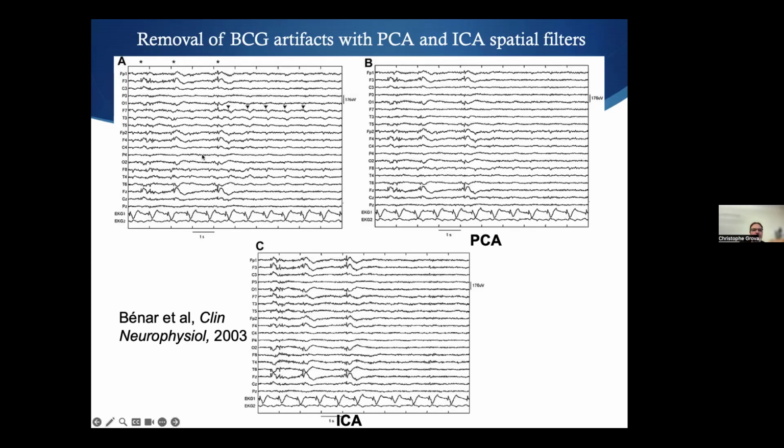And here you have an example of how it has been. So you have here the original data. You see 3 epileptic spikes, and then you see plop, plop, plop, plop, plop, which are the remainder of the ballistocardiogram. And it has been here nicely removed. We still see a little bit from the PCA, and we see clearly less here.